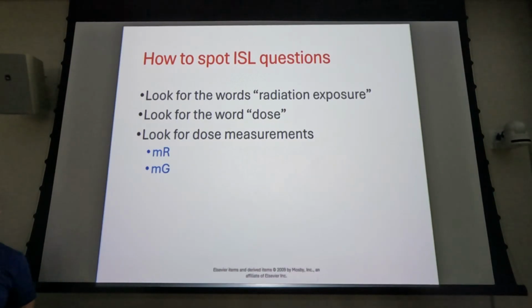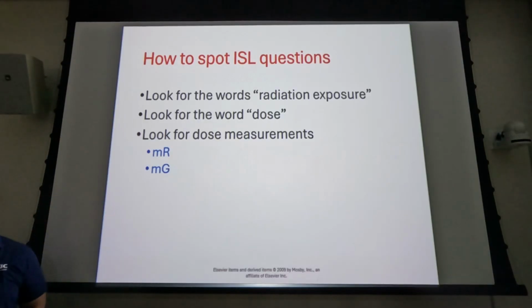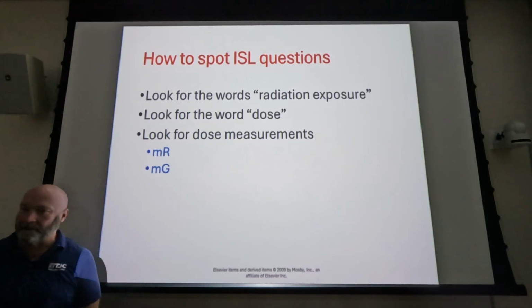When we get back into this in the sophomore year, we're going to make changes from 40 inches to 54 inches, so you're going to have to work problems. But for this semester, I just want you to know the concepts. I want you to know which direction and by how much. So rarely do we go from 40 to 80 inches. We go from 40 to 72 inches, and that factor would be 3.24. Right, now that really applies more to the direct square law than the inverse square law.